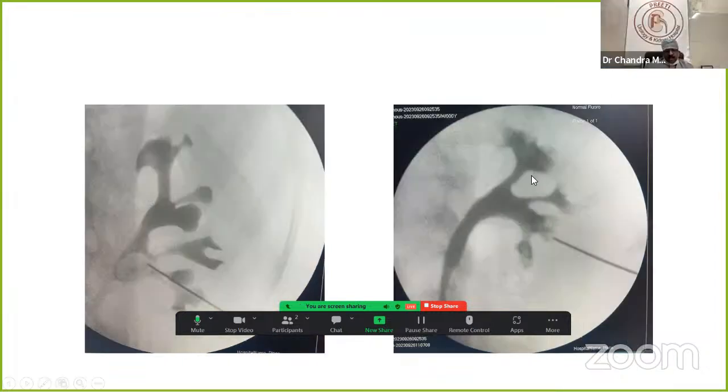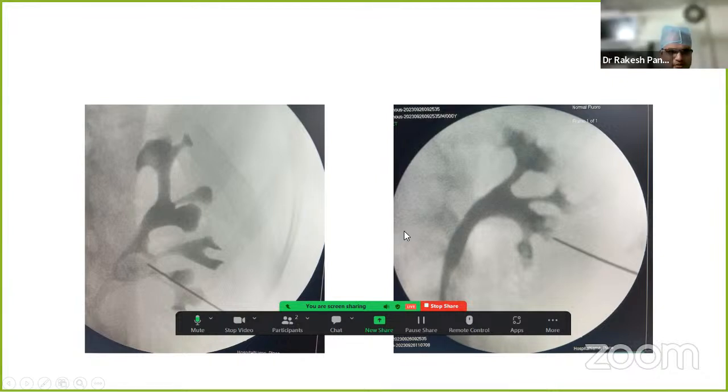Correct. You can see here, long narrow infundibuli. While fragmenting, the stone can migrate up like this. Then it is difficult to do an extra puncture for a small stone. We can take help of flexi and just bring the stone and give it to the nephrostome tract.